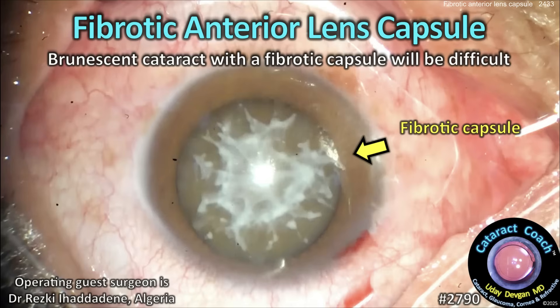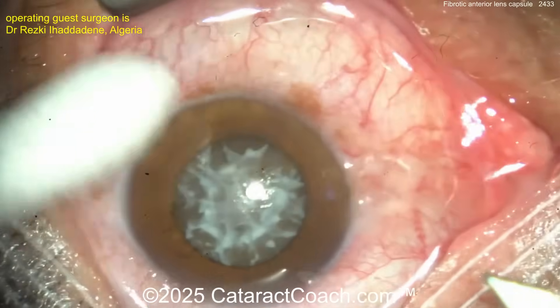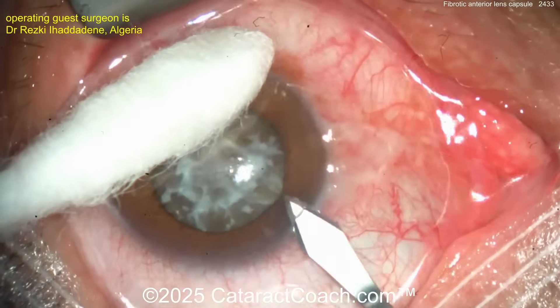cataractcoach.com. Fibrotic anterior lens capsule and a brunescent cataract — this is going to be a very difficult case, not at all easy. So let's watch carefully. The guest surgeon has good draping, sitting superiorly, making a main phaco incision.